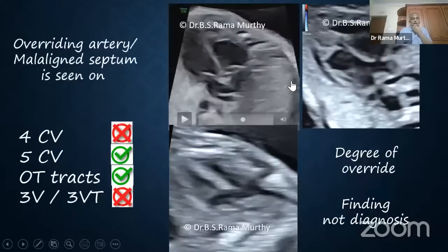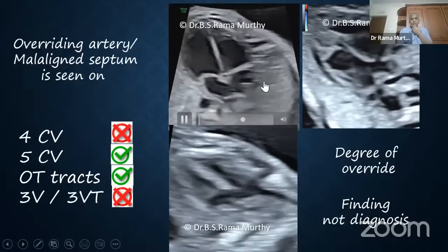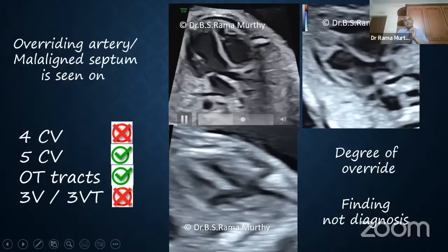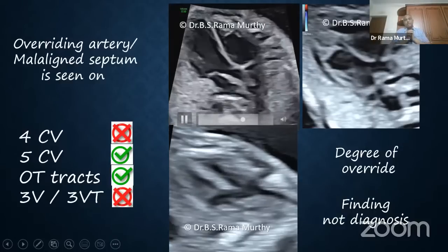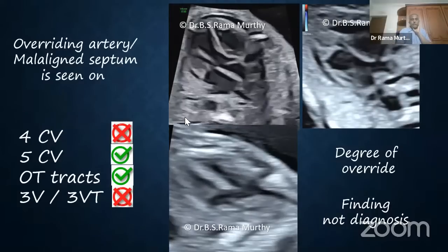Now let us look at what this malalignment is and how we actually look for it on ultrasound. First I'm going to play a clip which shows us a normal LVOT. I've started from the 4-chamber view and quickly turned into the LVOT.